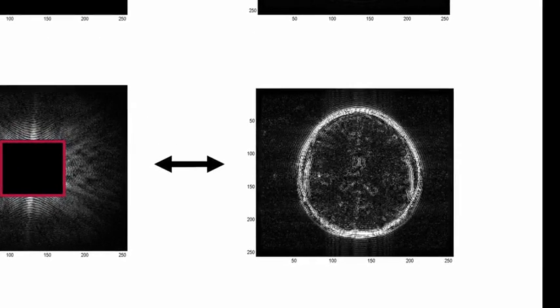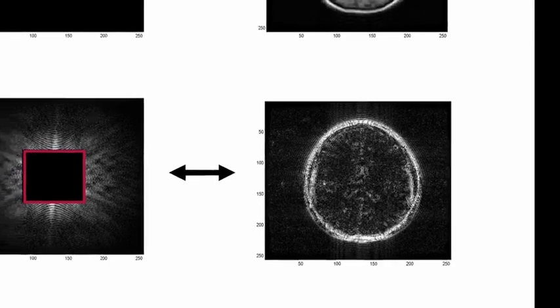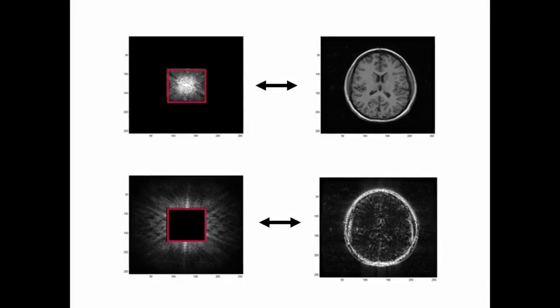So now we're only looking at K-space points that are far out, which correspond to sinusoids that are highly oscillating. And this is the type of information that we need in order to make out fine detail. As you can see, we can see the skull very well, and the boundaries between gray and white matter, and boundaries in general come up very well. Now, because the Fourier transform is a linear operation, these two images on the right hand side add up to the other image. So this is really a decomposition of the image into two parts.